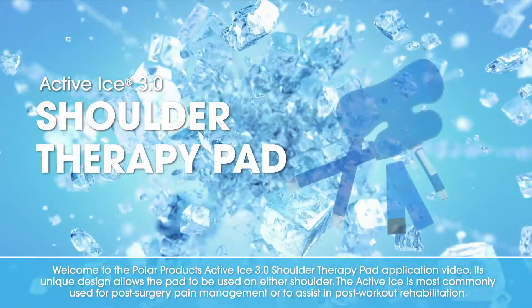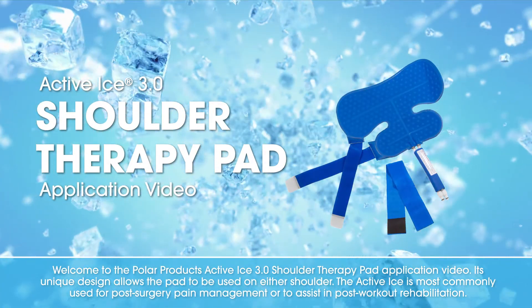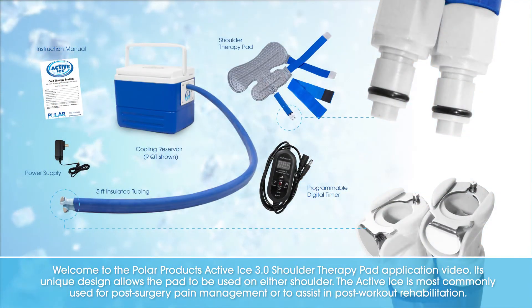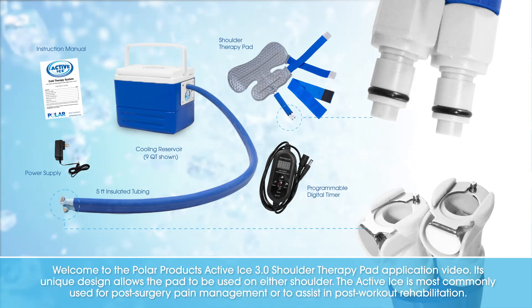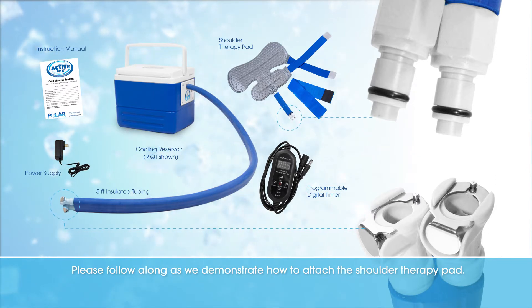Welcome to the Polar Products Active Ice 3.0 Shoulder Therapy Pad Application Video. Its unique design allows the pad to be used on either shoulder. The Active Ice is most commonly used for post-surgery pain management or to assist in a post-workout rehabilitation. Please follow along as we demonstrate how to attach the Shoulder Therapy Pad.